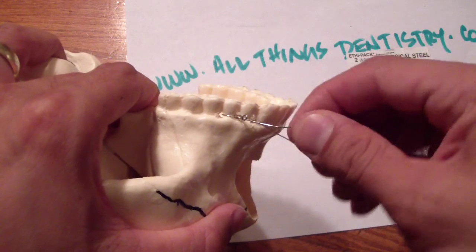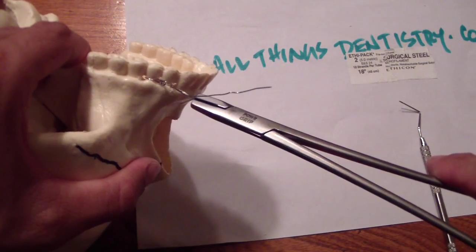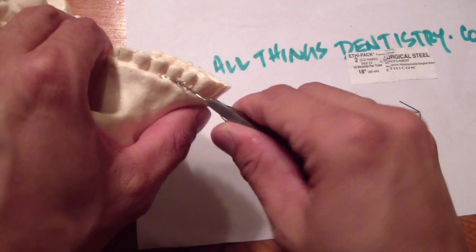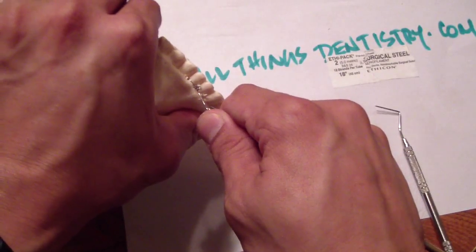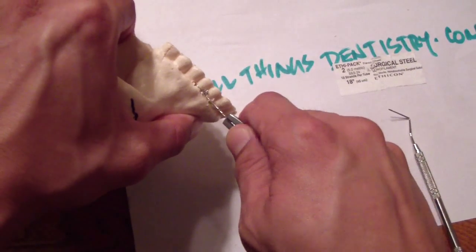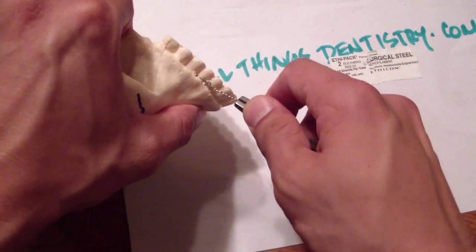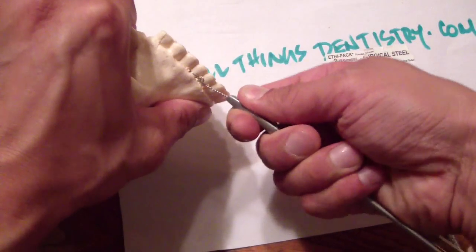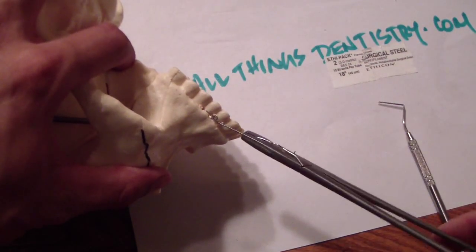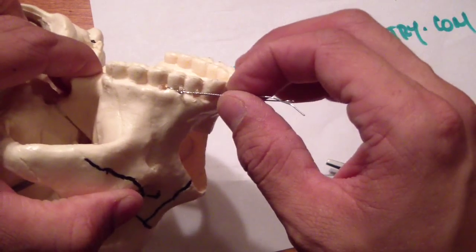Now we're going to tie these little pigtails — that's the word I've been looking for. The key here is to start tying a little bit out and away, and pull. Take all this in your hand, place a pop of pressure against the mandible or maxilla, and start turning and pulling the wire so you're stretching it and tightening it. You're not relying on the twisting motion to tighten, because it'll spin out and break — as you'll see in the video of the live patient where it broke a whole bunch because the patient was probably maxed on local anesthesia.